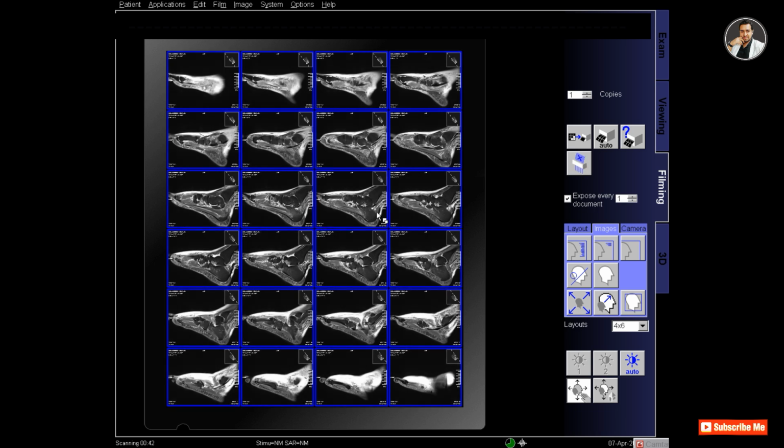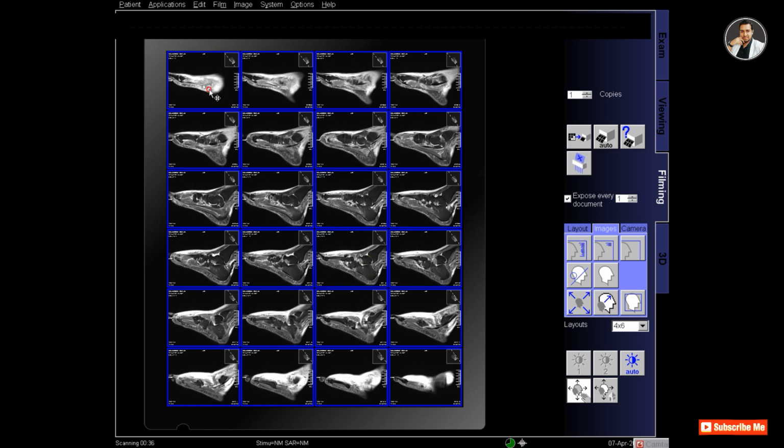And adjust the contrast of the image and slightly zoom pan so that the images are perfectly set in all the segments, and also keep a reference image in each segment and the patient's information.